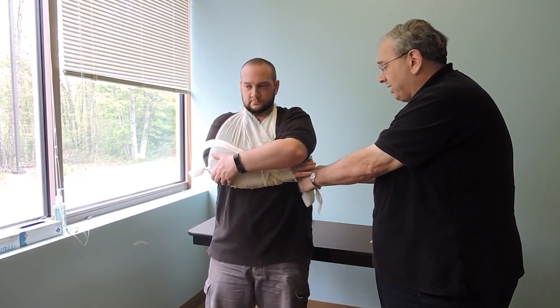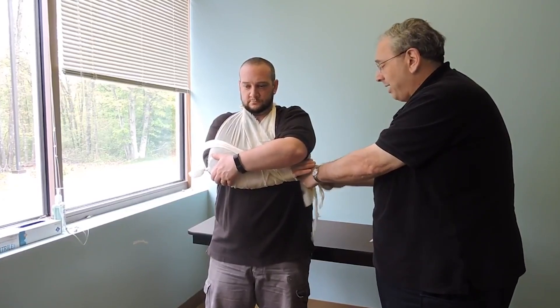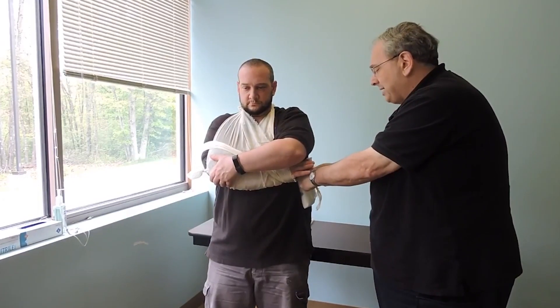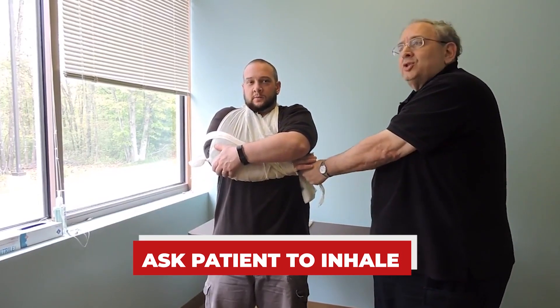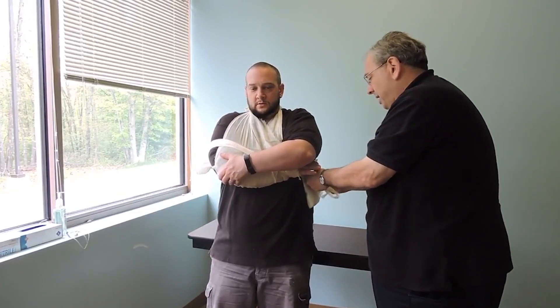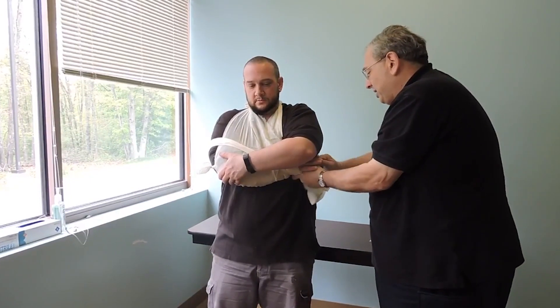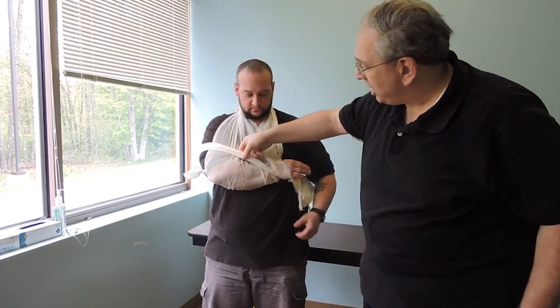I'm going to do that surgeon's knot again — loop it through once, loop it through a second time — and then I'm going to ask the patient to inhale. As he inhales, his chest pulls in. I'm going to tighten the knot, tie it again, and ask the patient to exhale. This should be snug — my patient shouldn't be able to move his arm away from his body.